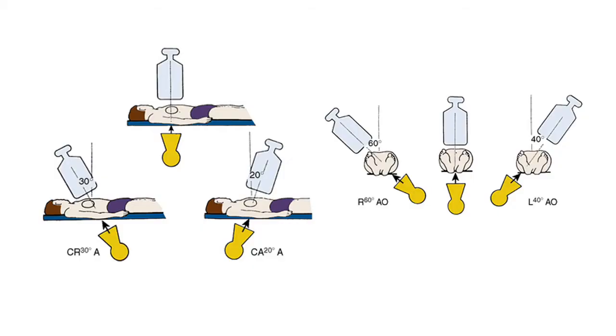The C-arm can be moved into various projections to obtain different views. Now it must be made clear that when you move cranially, it is the collecting tube that moves cranially. By extension, it is your face that is moving cranially. If the C-arm moves caudal, left or right, your face or collecting tube is moving in those directions.